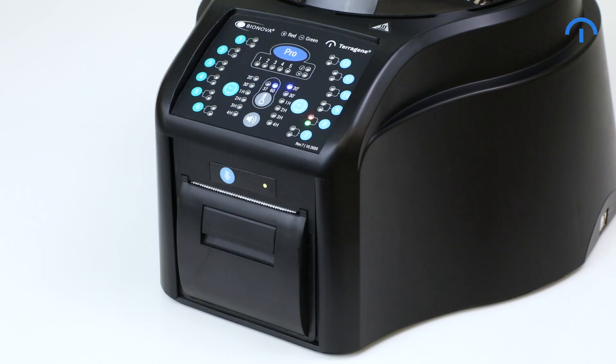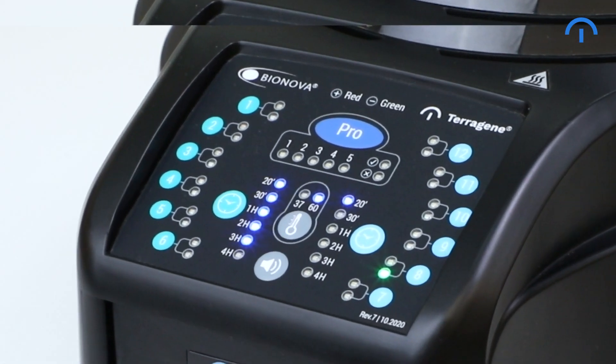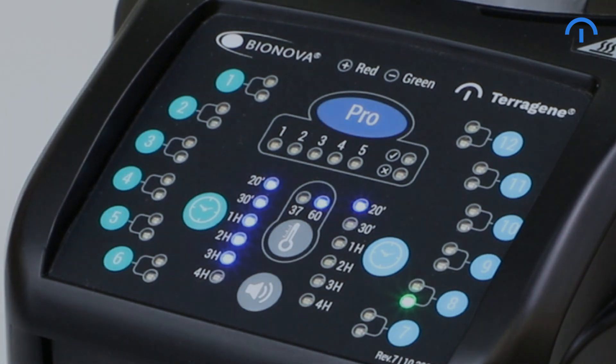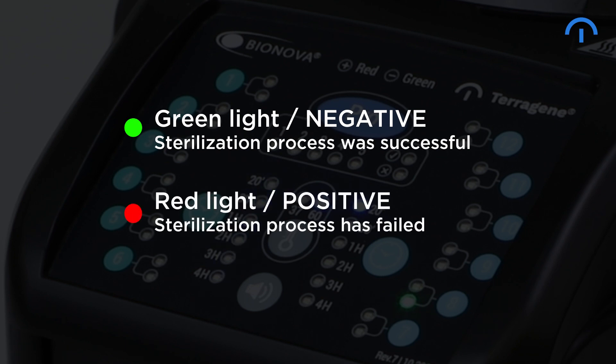When the readout process is done, the IC1020FR will print the results and display a red or green light. The green light means that the sterilization process was successful, while the red light indicates that the sterilization process failed.